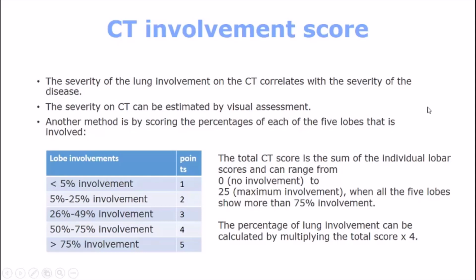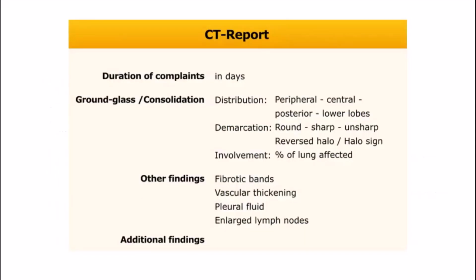This is good also for following up the patients. In their follow-up images, we can compare the lung involvement. Has it increased? Has it decreased? And I think it's a very good way also to communicate with clinicians, and it will contribute to a better care of the patient.